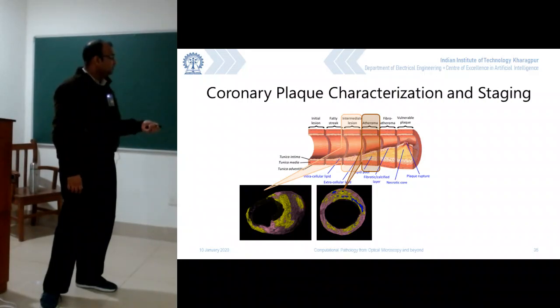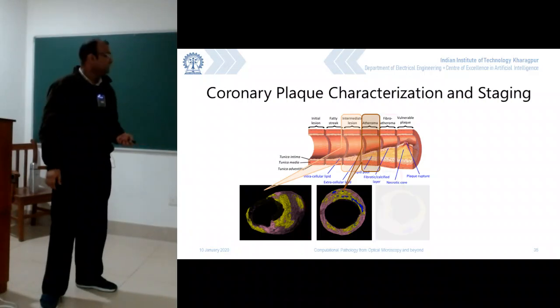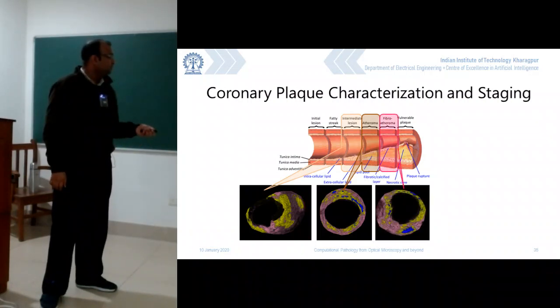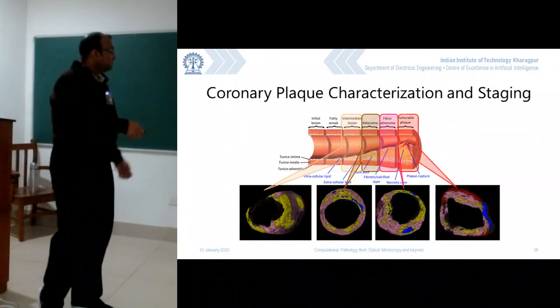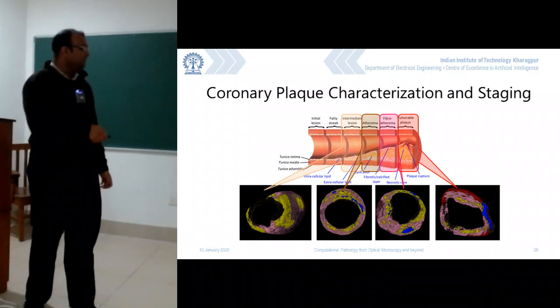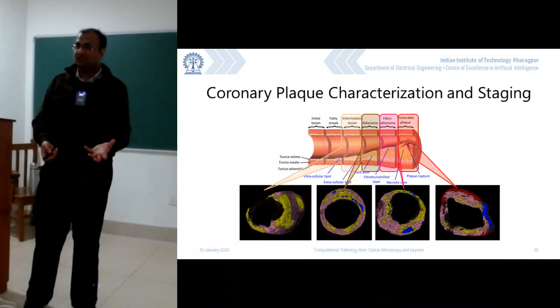This is an atheroma stage, when you have the first part of hardening, so you will have distinct calcifications setting up. Then there is fibroatheroma, when you would see that there are solid calcifications, as over here in blue, and then you have some part of necrosis also setting in over here at the 9 o'clock position. And then eventually you go to this most vulnerable position when you have a lipidic pool which is very close to the internal boundary and it can rupture at any point of time.